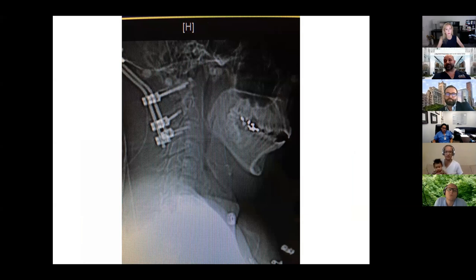And at the very end, I promise you I'd show you this. I told you, look at Dr. Dahdaleh's X-ray, the fluoro, and look at the angle of the mandible. So Nader, I'm going to flip the case on you here. What's your comment on this OC fusion?